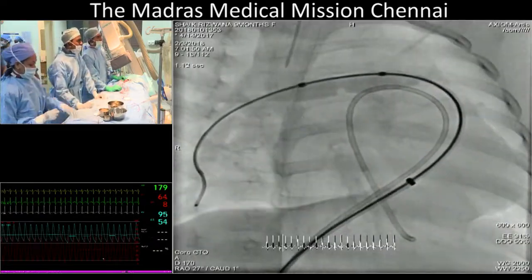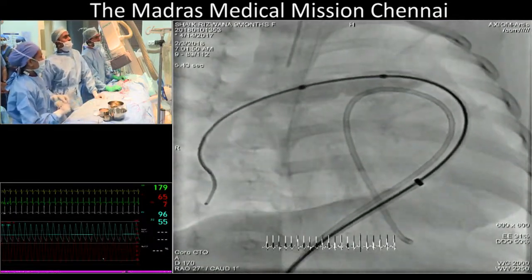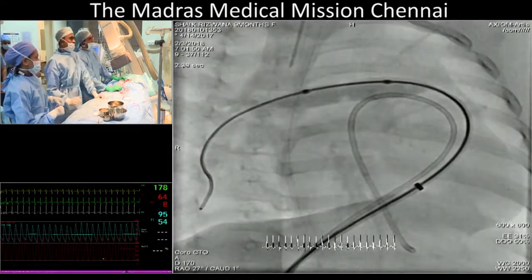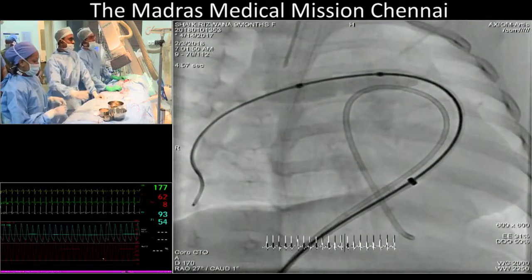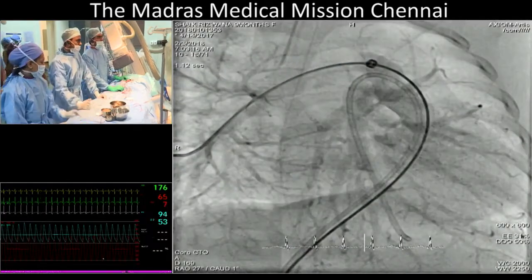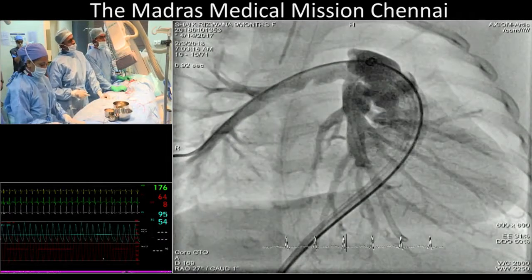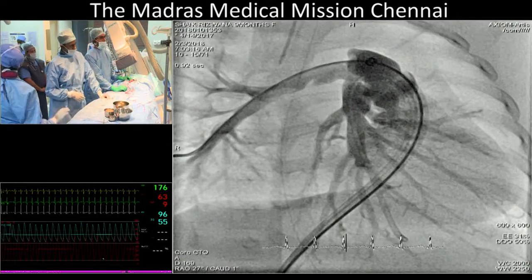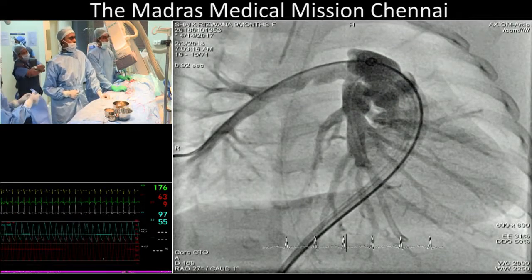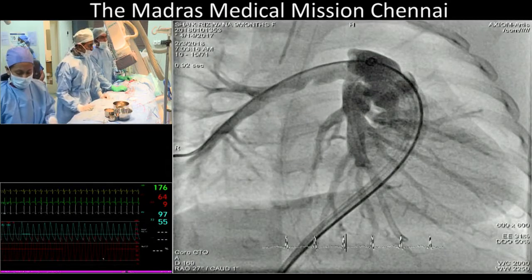You did a very good job. So this is Tyshak, it did a very good job in this. And now this is a Mustang, Boston Scientific. Next picture. Freeze it. So what pressure did you go up to, Siva, with that Mustang? The Mustang, we went up to around 12 to 14. Okay, that's a 6 millimeter Mustang? No, it's an 8 millimeter Mustang.